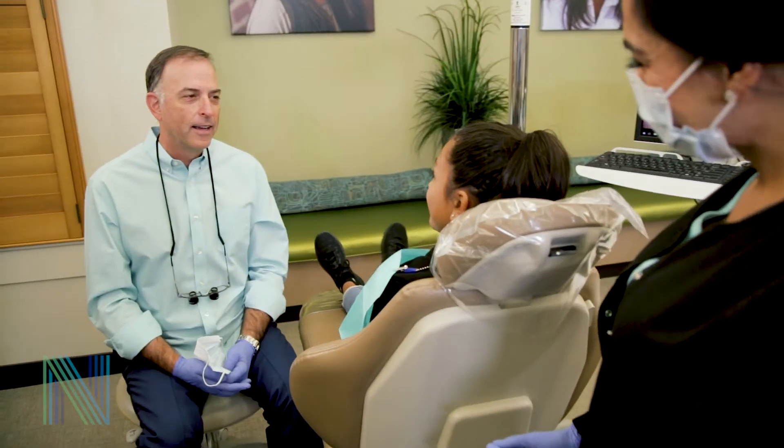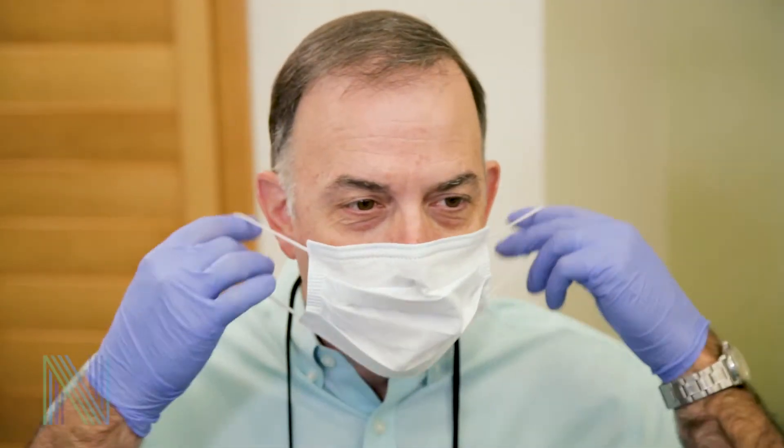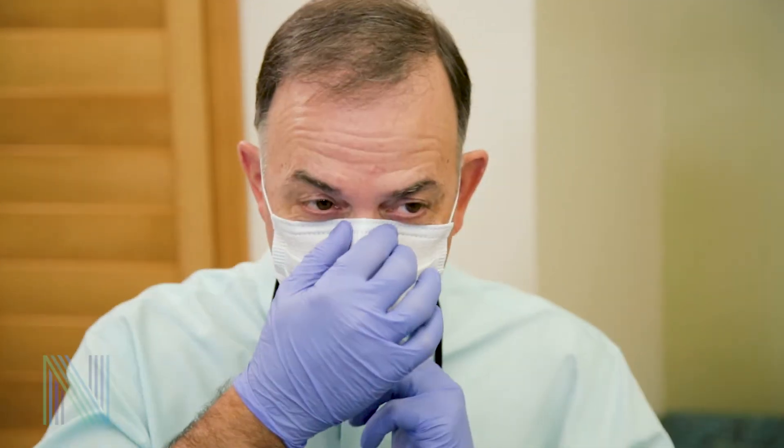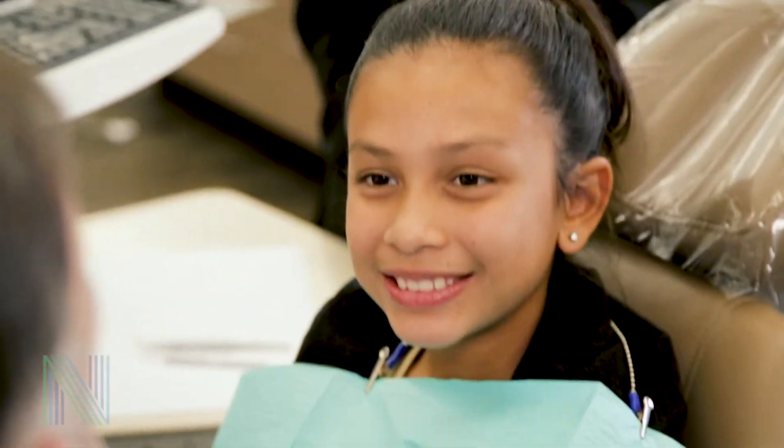We typically place the spacers between the selected teeth about a week before we place your appliances. During this time, you can eat most of the same foods you already enjoy, but we recommend avoiding sticky, chewy, or gummy foods to ensure the spacers stay in place.